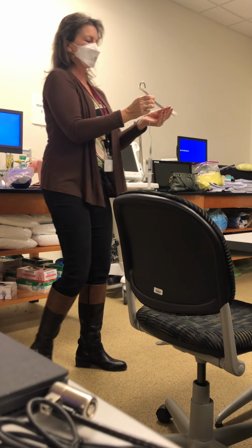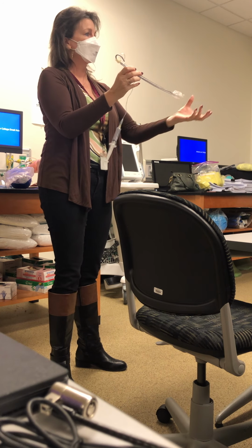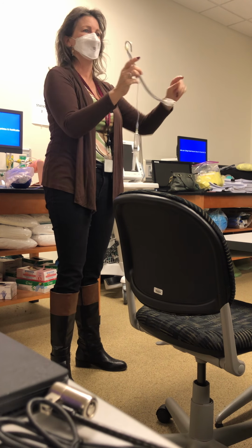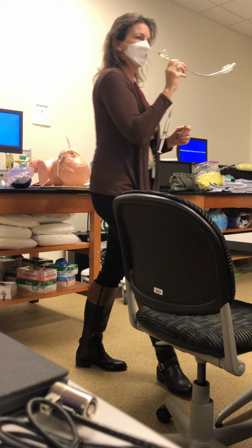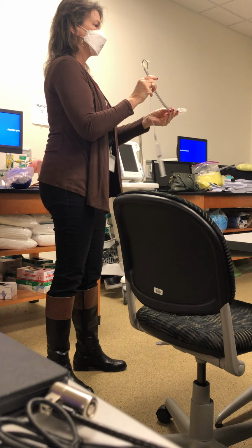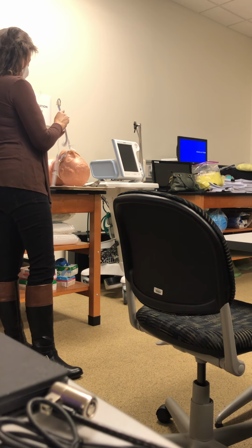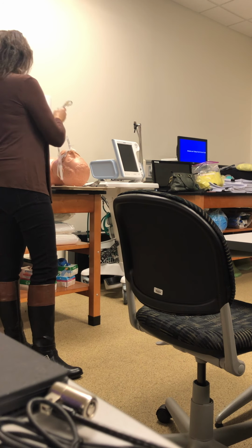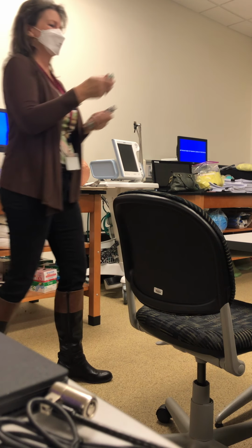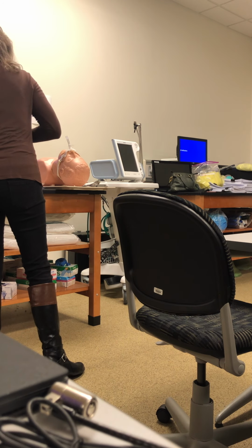So we have this rigid tube here because we have the stylet in here, and with the sleeve that's on, you could just kind of angle it a little anterior because lots of times that trachea is a little more anterior, okay? So we're going to bend it a little bit for the physician. Okay, so we have done that, and when we're going to intubate, okay, I want everybody to try this. This blade, we need a laryngoscope and a blade.